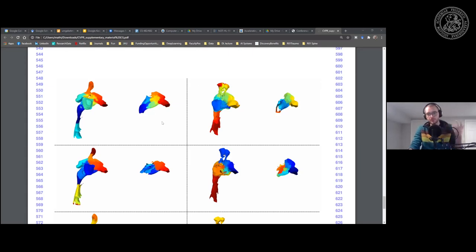So you can already see that by learning these representations on these surfaces, aligning these becomes a relatively easy problem, because you can rely on the surface representation to align these surfaces. And that then solves this registration problem, which allows us to close the loop to the preoperative CT and then navigate with respect to the preoperative CT.